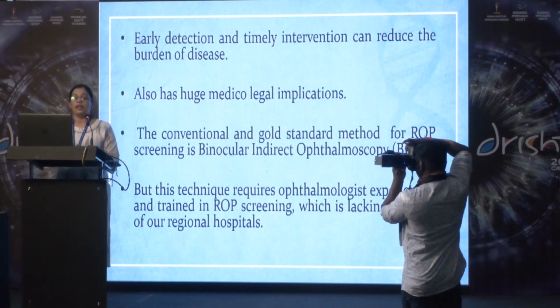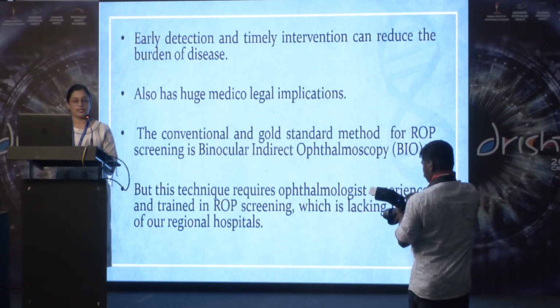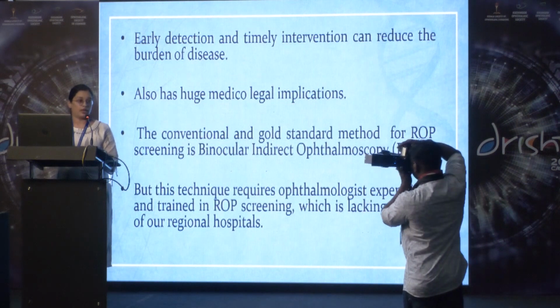into a lawsuit. The conventional and gold standard method for ROP screening now is binocular indirect ophthalmoscopy, but the problem is that this technique requires an ophthalmologist who is experienced and trained in ROP screening, which is lacking in many of our regional hospitals.